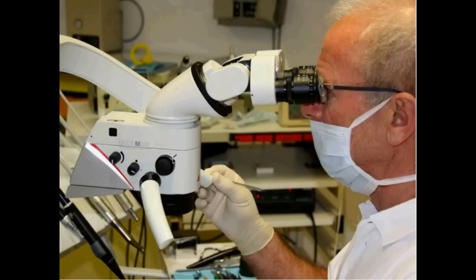Another interesting question: what are the differentiating features between microscopes and magnifying loupes other than ergonomics? Well, of course, the magnification of microscopes is a lot higher, or can be a lot higher if you wanted to. That's really the only difference I can see. A loupe will have a maximum of 7 to 8 times magnification, and the microscope up to 25.